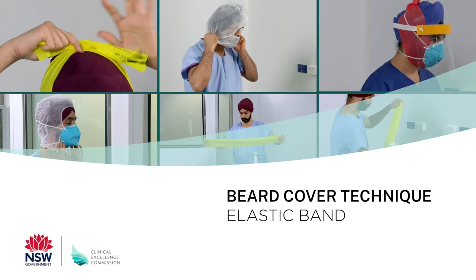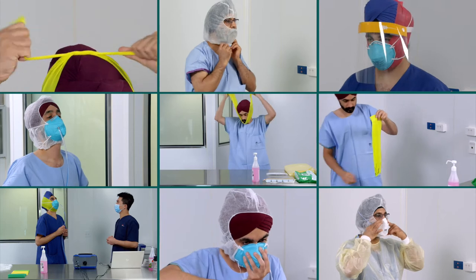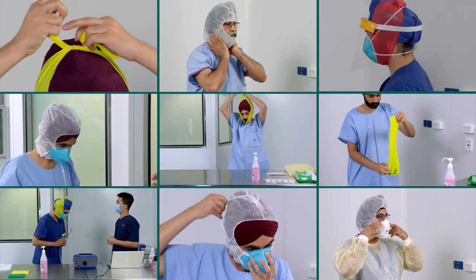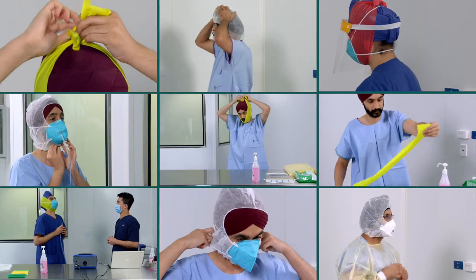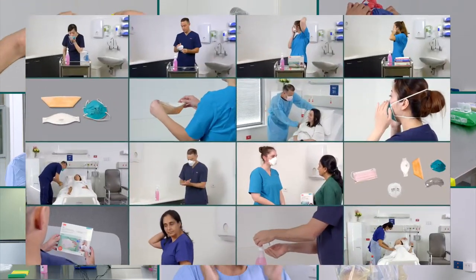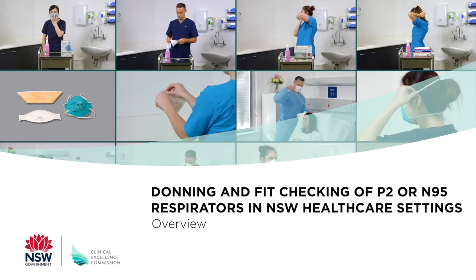This video forms part of a series on donning, doffing and fit testing of disposable P2 or N95 respirators using a beard cover technique in New South Wales healthcare settings. It's important to refer to the Clinical Excellence Commission's other resources on the use of respirators for general guidance.